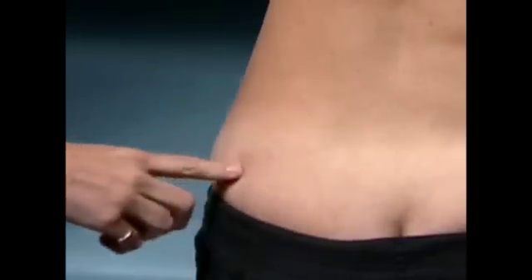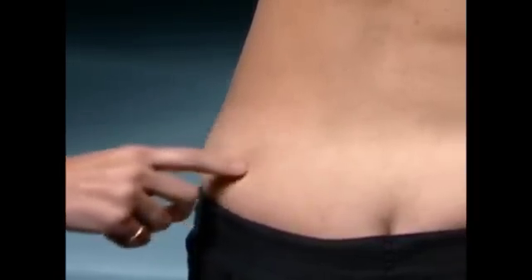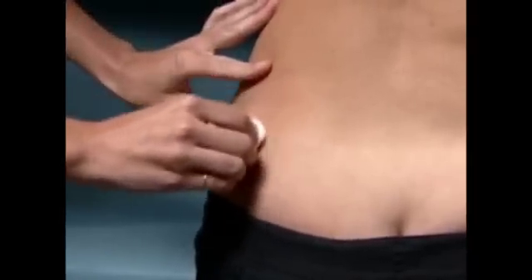For intramuscular injection, choose an injection site as directed by your health care provider. The upper outer quadrant of the buttocks will be demonstrated. Alternate sides each day. Clean the injection site with an alcohol wipe and let air dry.